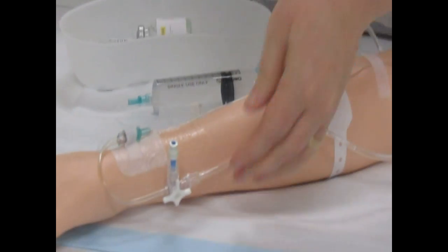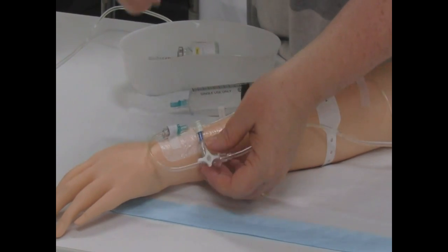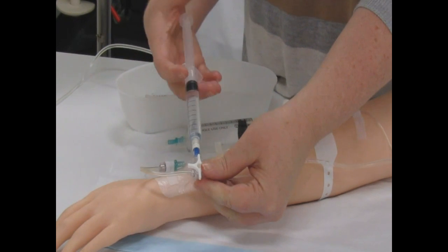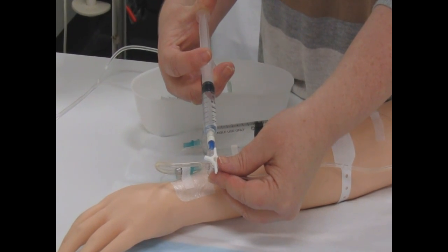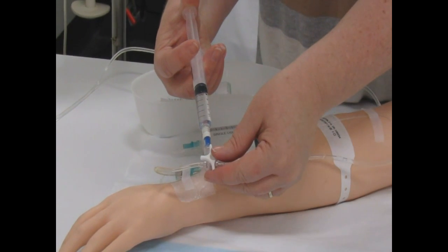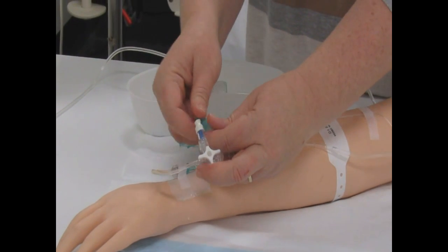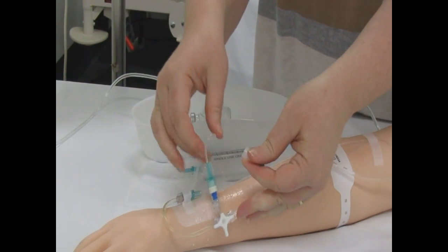With my flush, I'll just make sure there are no air bubbles. Even though there is some fluid running, I'm still going to attach that and push nice and slowly through about 5mls, just to make sure it is running nicely and there are no leaks or any puffiness at the site to tell me it has been compromised. I'll turn that off while I remove it, and then while I've got that site up and clean, I'm going to attach my insulin infusion — that way I don't need to re-clean that.